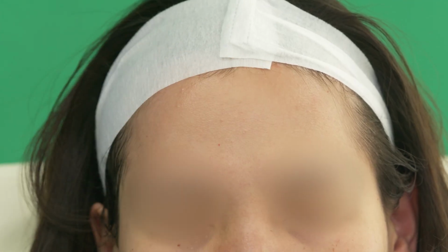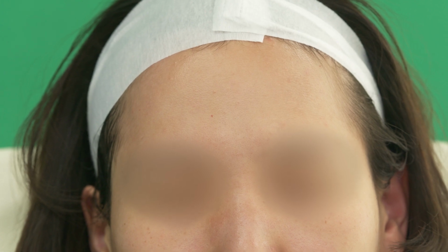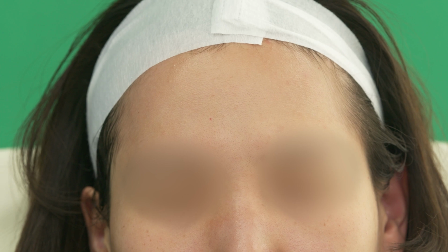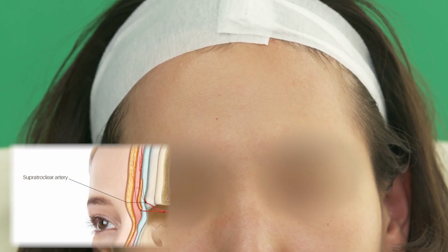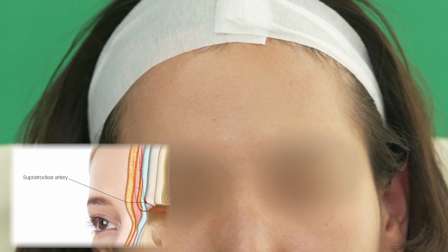The glabella can reveal some of the most common signs of facial aging, such as the glabellar lines, also known as frown lines. So several procedures are performed in this region to enhance its appearance. However, one of the terminal branches of the ophthalmic artery, the supratrochlear artery, runs in this area.